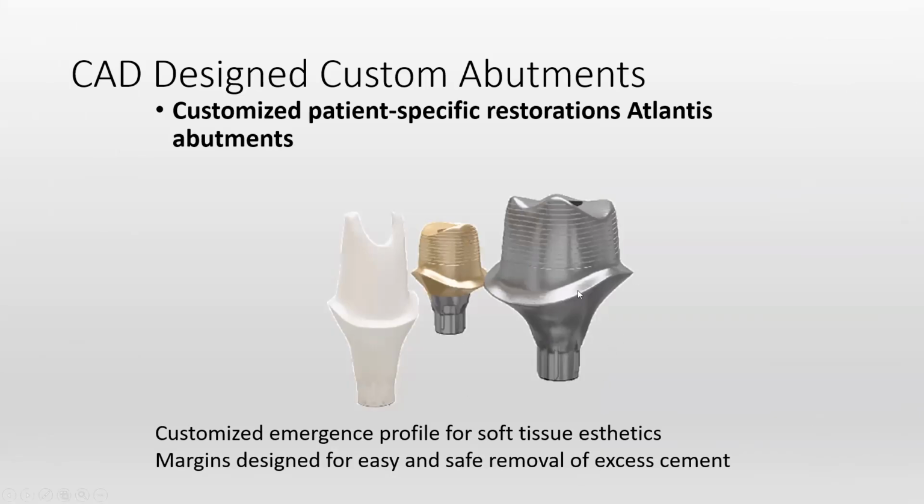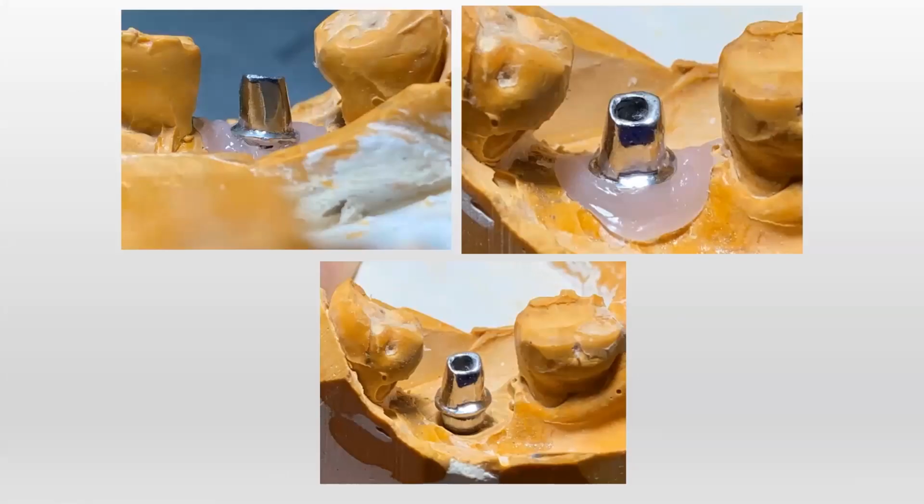We can see how the finish line is, and this is the soft tissue profile that is being developed in the patient's mouth. So this is a case where the custom designed abutment is milled in titanium.